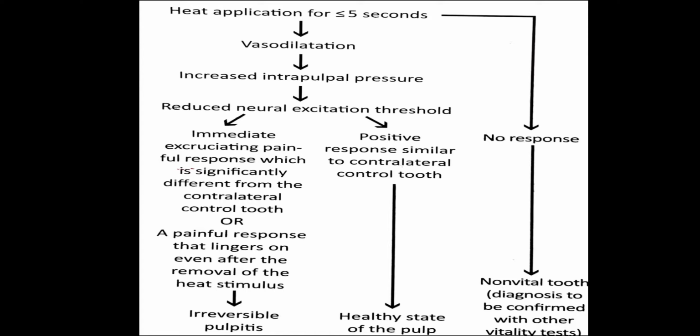Mechanism of heat test. Heat is applied for 5 seconds. If no response is seen, then the tooth is said to be non-vital. However, the diagnosis is confirmed with other vitality tests.